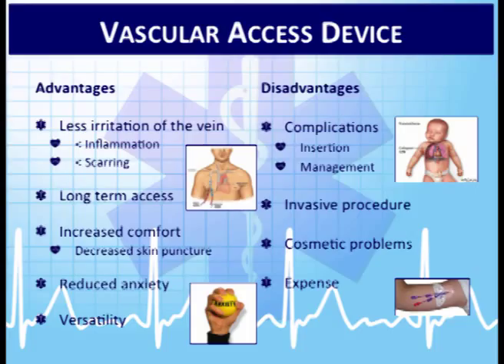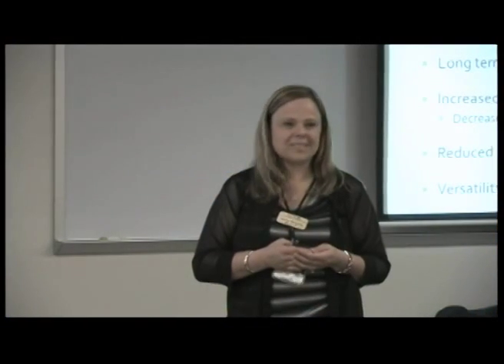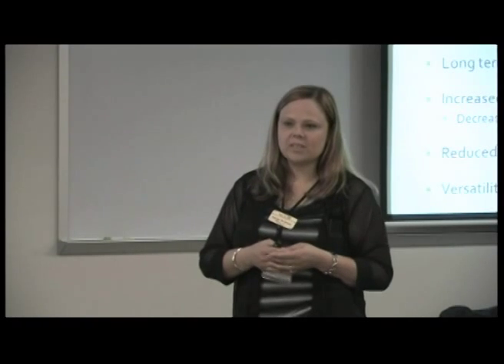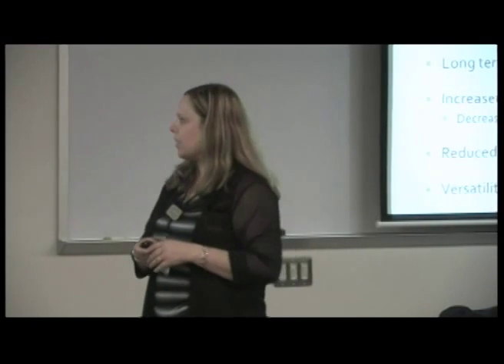It is an invasive procedure, so with invasive procedures there's always risks associated, including infection. Cosmetic problems, maybe for adults it may not be as dramatic to have a port put in or a PICC line, but I worked at Children's Hospital for 4 years in the cardiac ICU there. There's lots of children that end up with PICC lines, and sometimes they have to go home with them, and that's not the coolest thing to have. A toddler is not going to mind that it's there because they get used to it, but if you're a teenager and you go home with a central line or a PICC line, cosmetic problems becomes a big thing. And expense is also another disadvantage.